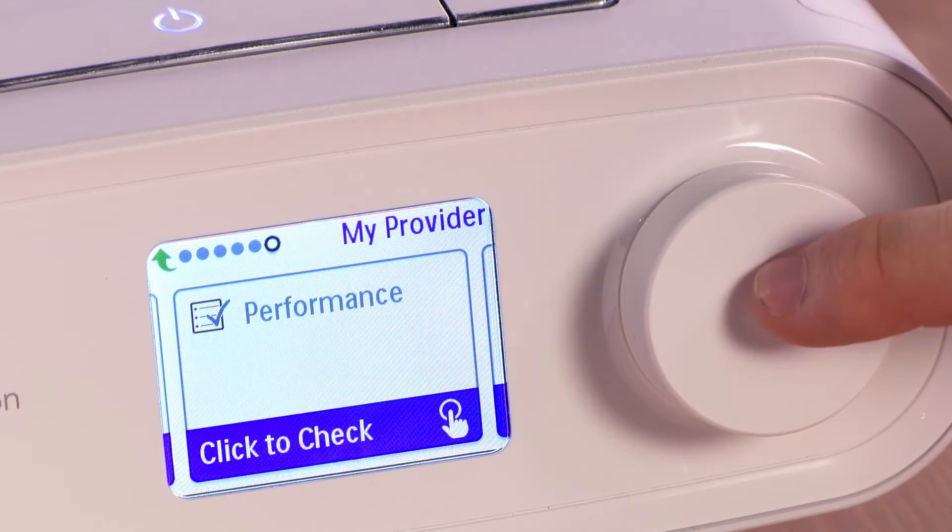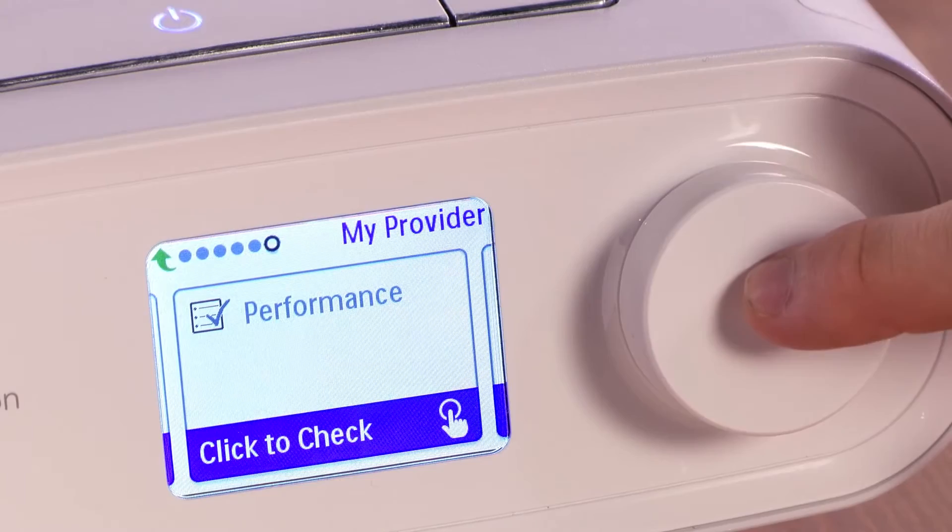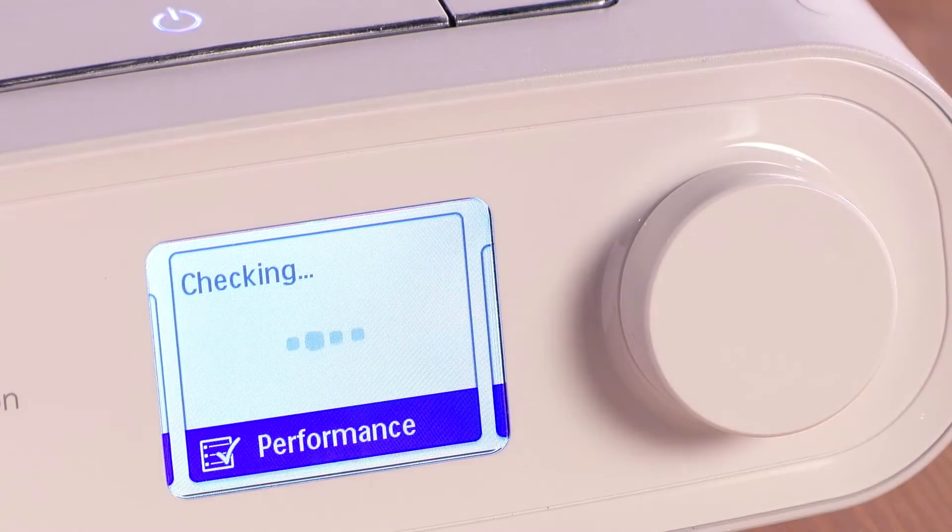Push the control dial to run a check when requested by your provider. Once initiated, Performance Check will operate your device for up to one minute.